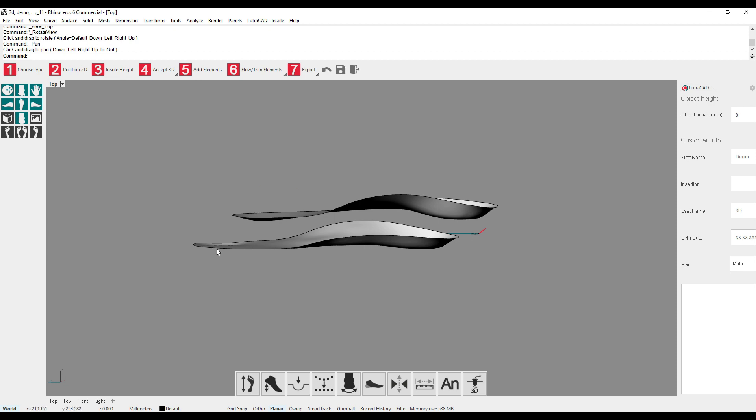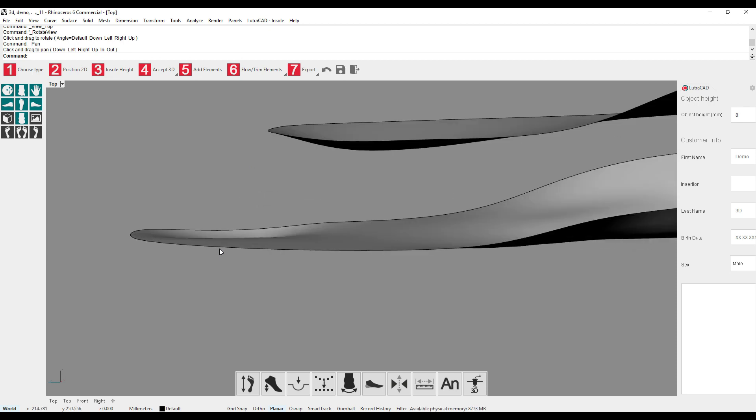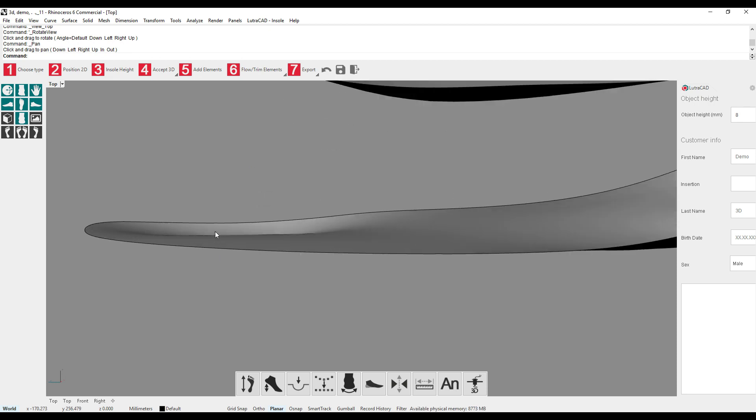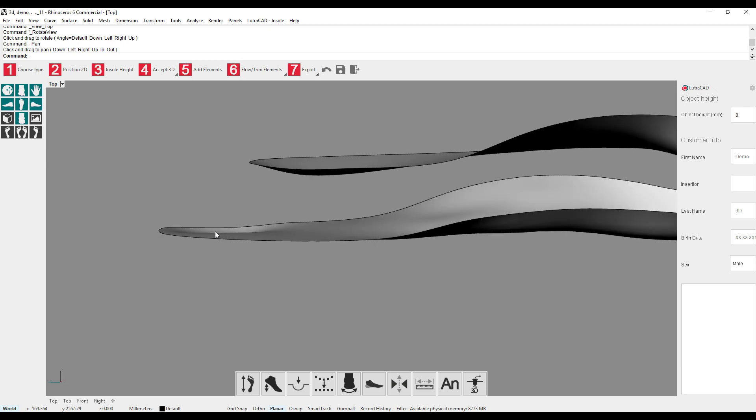It is also possible to zoom. It will zoom where your mouse cursor is pointed. To zoom in, we can use the mouse wheel forward and to zoom out, use the mouse wheel backwards.